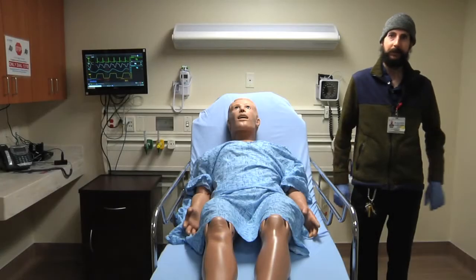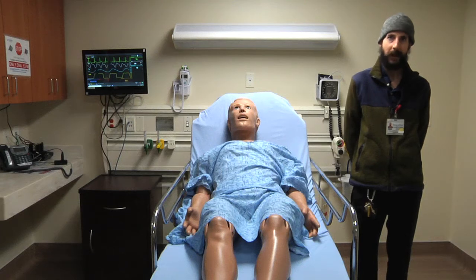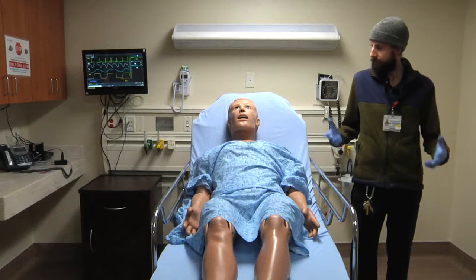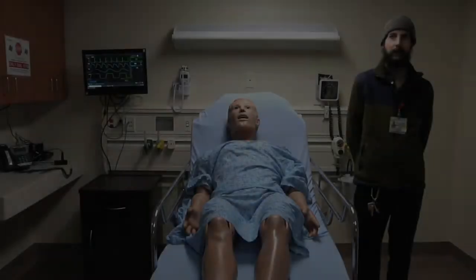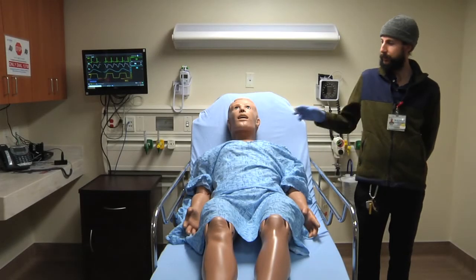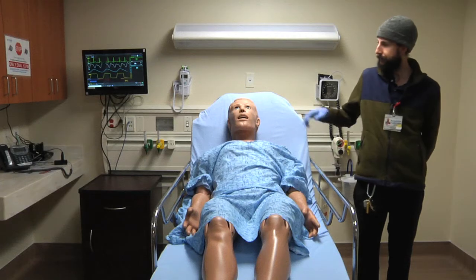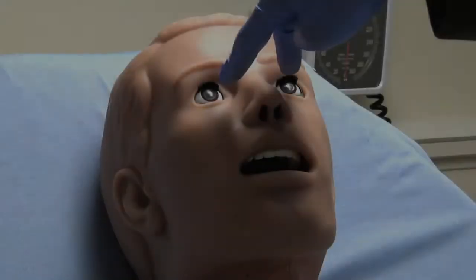So remember, this is a safe learning environment, so feel free to ask questions, consult with your teammates, and have a little fun. So before we go, we please ask that you treat HAL as a real patient in the hospital, be respectful, and please do not poke our patient.